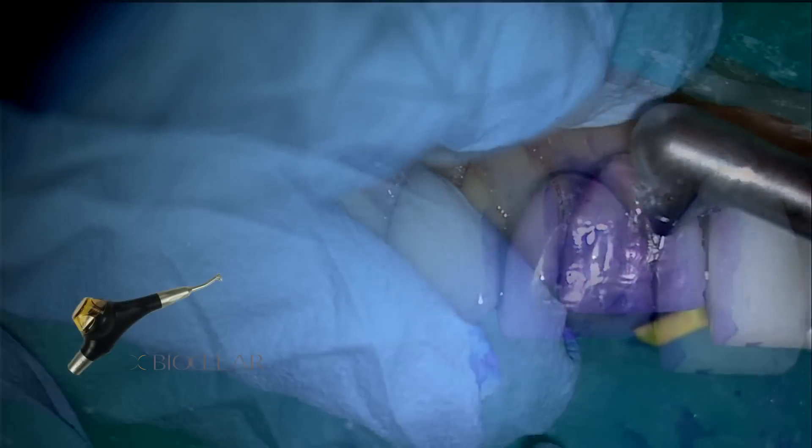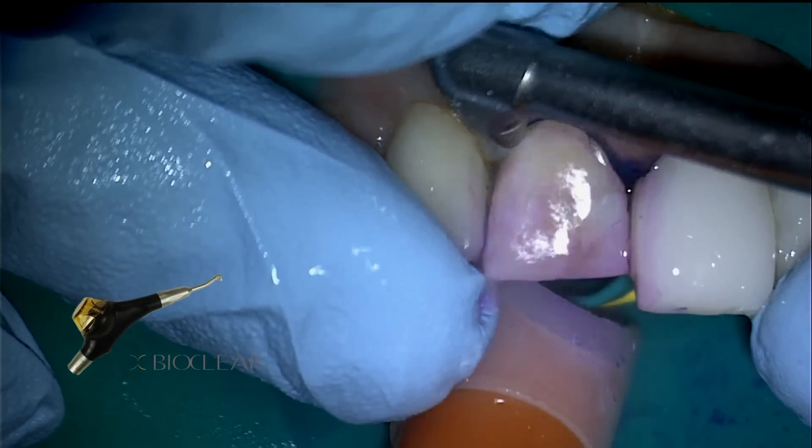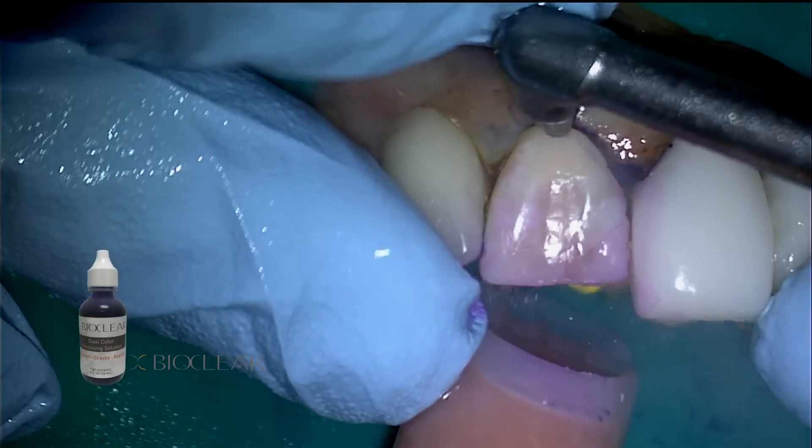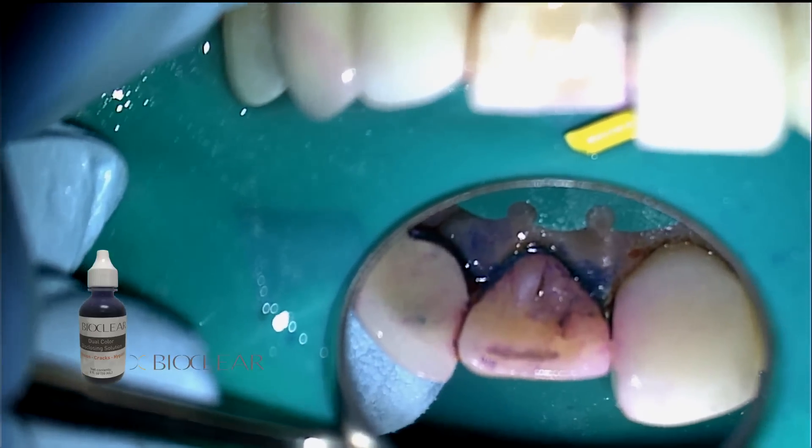The BioClear BioBlaster is utilized with aluminum trihydroxide powder to remove biofilm, which has been previously stained with a disclosing solution, which is included in the 360 veneer kit.